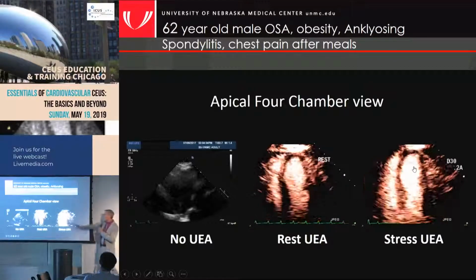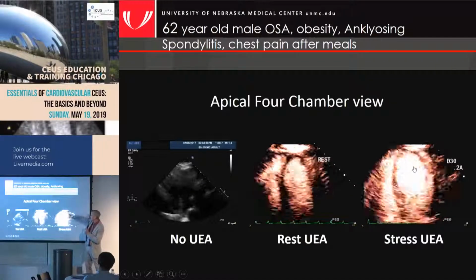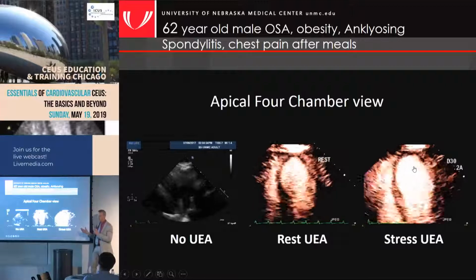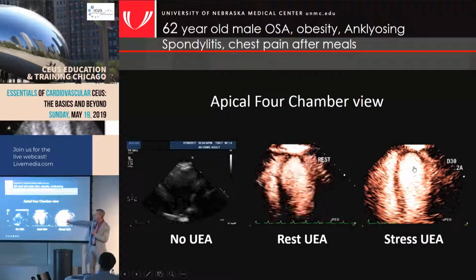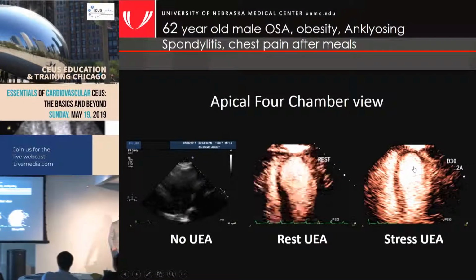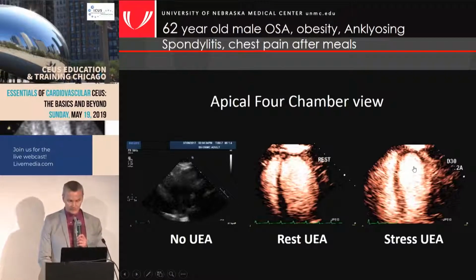Now there are some cases where people want to move this up maybe into the near field if they feel there's some cavity destruction here. But we routinely take our TGCs, time gain compensations, and give them a slightly higher position in the near field, because there's a built-in compensation mode in the iE33 that was corrected in the EPIQ. But we noticed that we still have to do it a little bit with EPIQ as well, where you still have to turn the TGCs up a little bit in the near field to avoid some of that apical artifact. But good point. Yes, focus should be at the mitral valve level or lower.